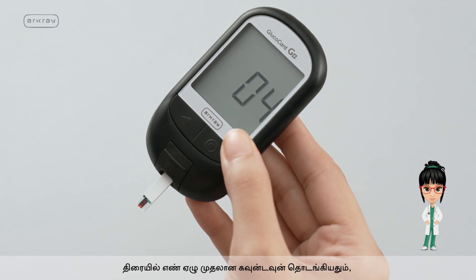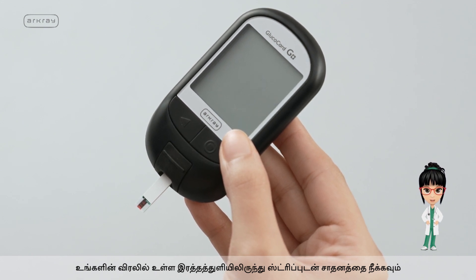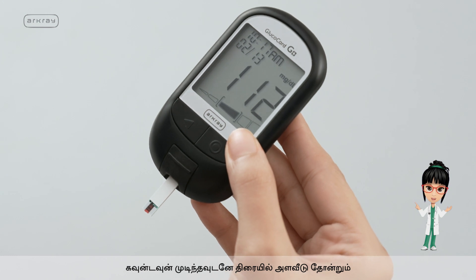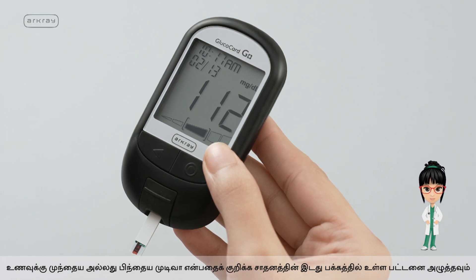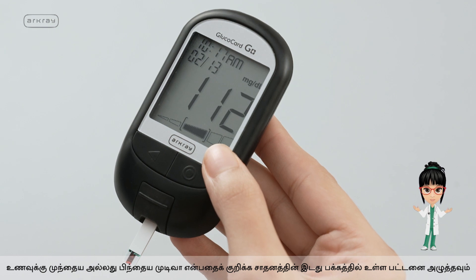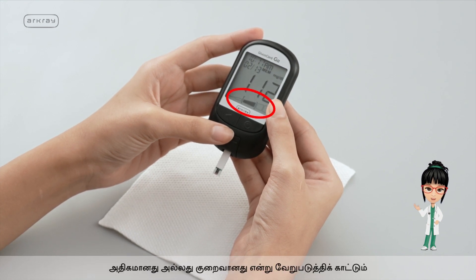As the countdown from 7 begins on the screen, remove the device with the strip from the blood drop on your finger. The reading will appear on the screen as soon as the countdown ends. Press the left button on the device to mark whether it is a before or after meal result. The result level indicator will classify your test result as normal, high, or low.